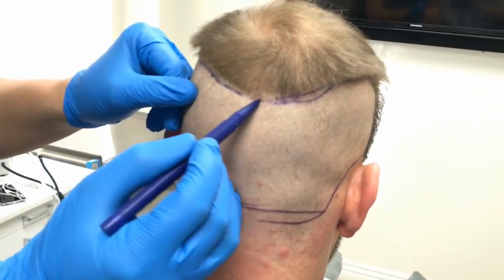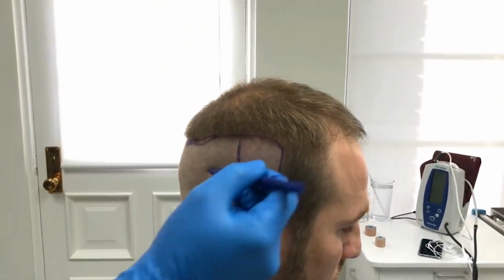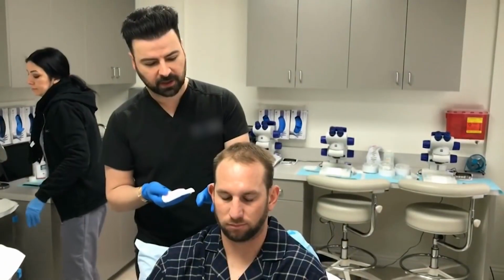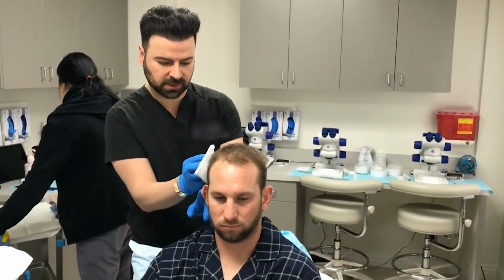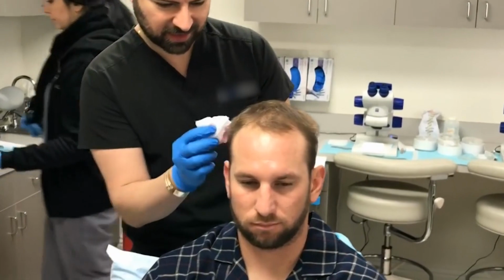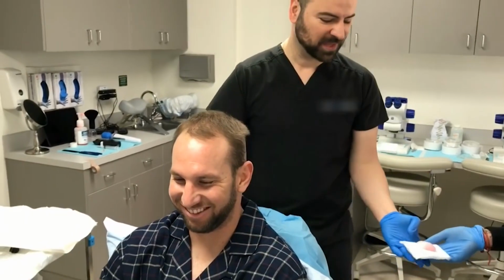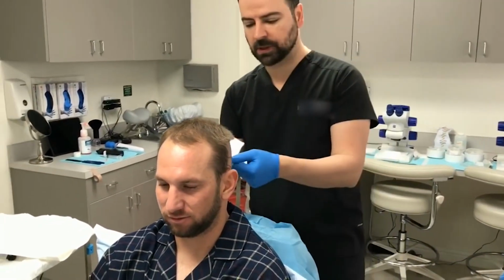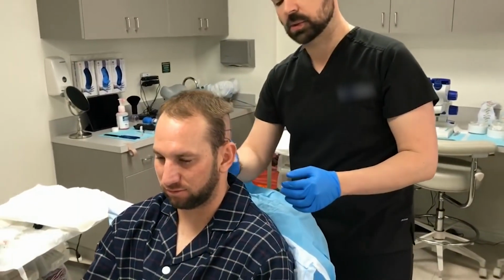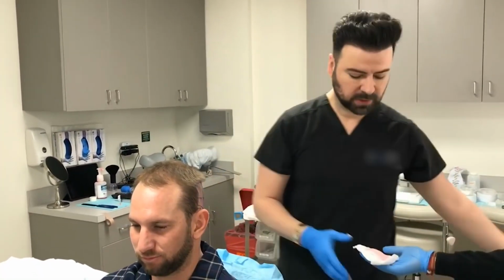If I can please have a disinfectant. Disinfect, okay? So this is a little bit cold, apologies. It's supposed to be room temperature, but I know it's cooler. Some patients say it's very cold. Refreshing. Awesome. So what we're going to do after this is we're going to numb the area. We're going to do a nerve block. Okay? That's the worst part for this procedure, for this phase. One more disinfectant, please.